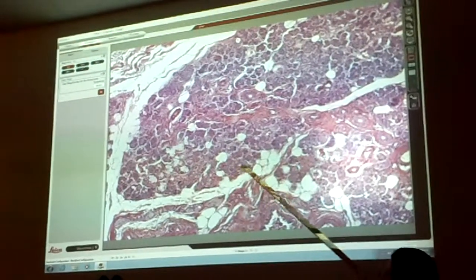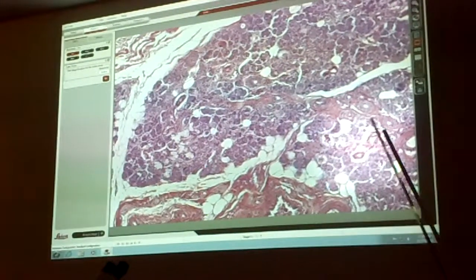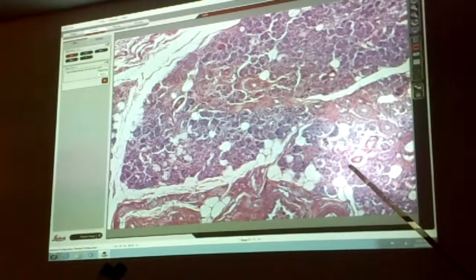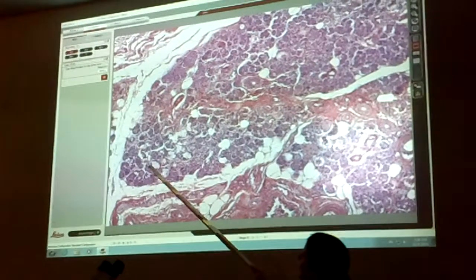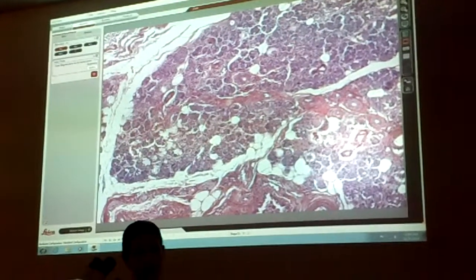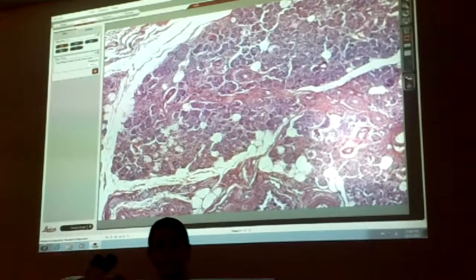And then all the background. Serous acini. A little rougher on this, but salivary ducts found. Serous acini. What was this again? Adipose. Don't fall for that. So you may have to, on your slides, look around a little bit more for the mucus acini, but they're there, and they look better through the scope than they do on the screen. All right, any questions on the submandibular?